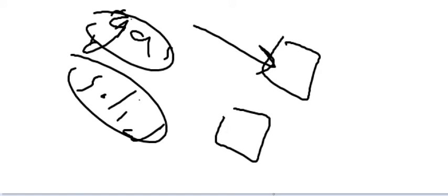Second reason why, because when you have this box and a photon hitting it, because it is gas, not very dense, it might hit this and also go to the next one. So it can be detected twice, making a less good image. One photon should be detected one time. That creates noise. While if it is solid, it's so dense, the photon comes here and is stopped by the dense material of the detector. Nice.